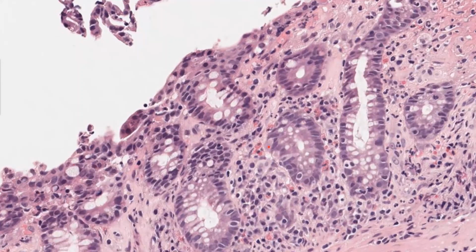Let's look at the number of lymphocytes. Do you see any increase in the number of lymphocytes? Yes or no? Within the epithelium? Anyone? Just have a look. What do you think?